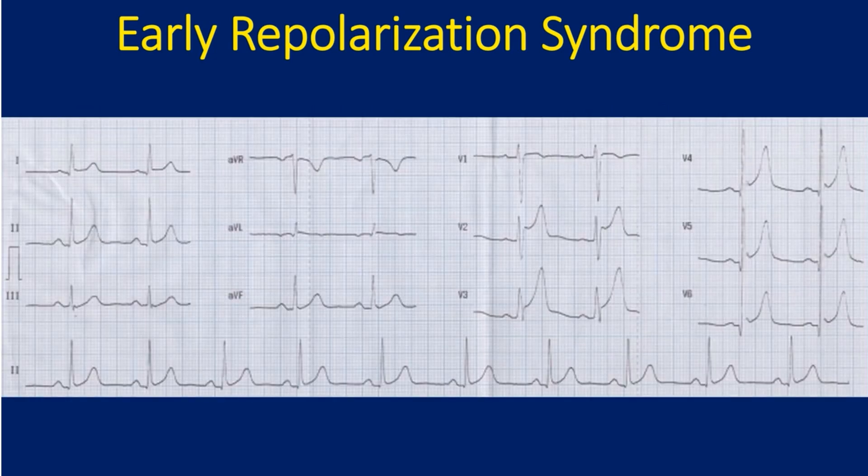Another ECG showing early repolarization syndrome is evidenced by the concave upwards ST segment elevation in leads V2 to V6. A closely similar pattern can occur in the hyperacute phase of myocardial infarction. Moreover, persons with ERPS can also develop myocardial infarction. So if the clinical history is suggestive of ischemic cardiac pain, it is better to have follow-up with serial ECGs and troponin estimations.